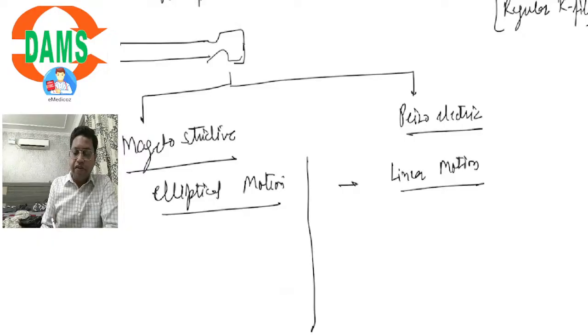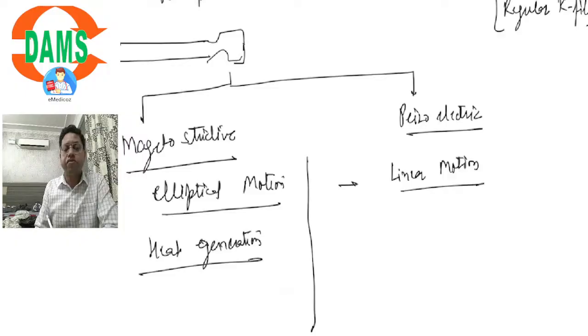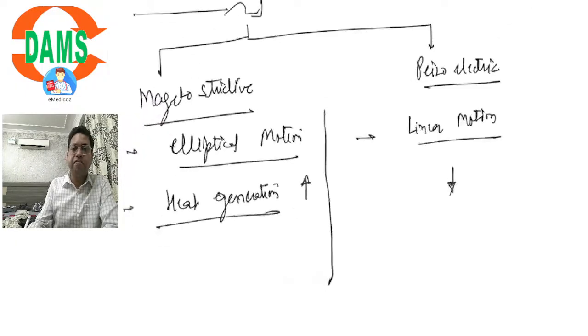If we look at the heat generation, whenever they vibrate at ultrasonic frequency, heat is generated. It is more for the magnetostrictive and less for the piezoelectric.